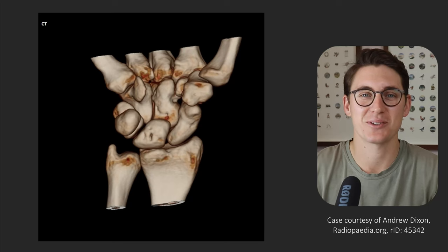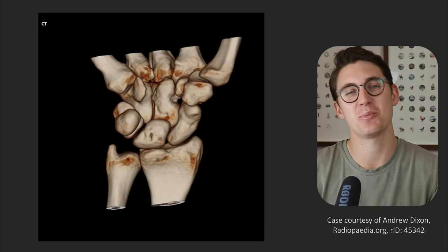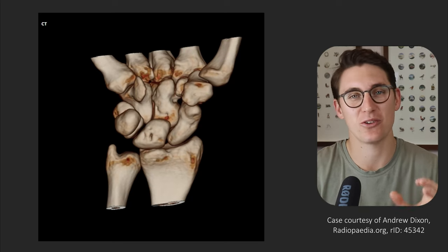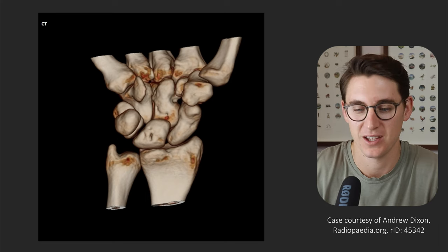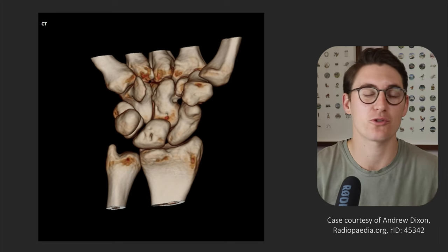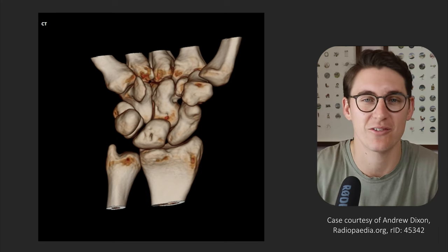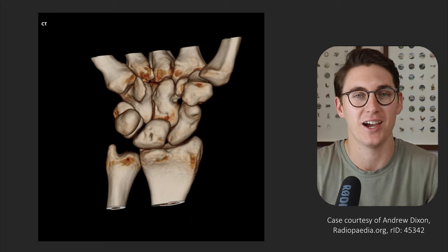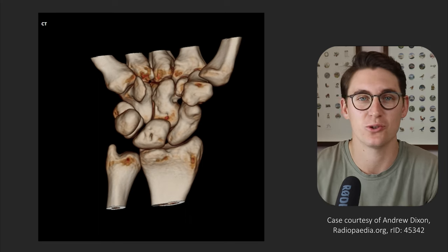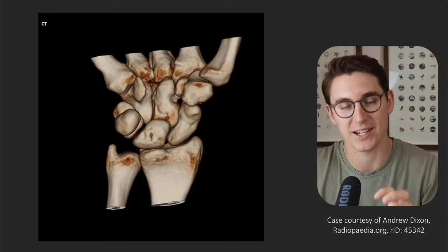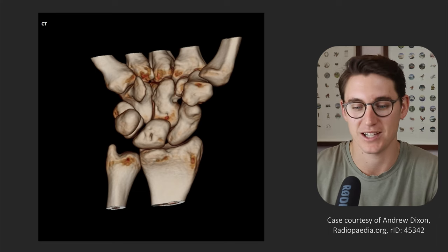Hello everybody and welcome back to another anatomy tutorial. Today we're going to be looking at the anatomy of the wrist in the wrist MRI. This talk follows on from our wrist radiograph talk, so if you haven't looked at that, I'd highly recommend starting there, then moving on to the 3D anatomy of the wrist as we're going to be looking at today.